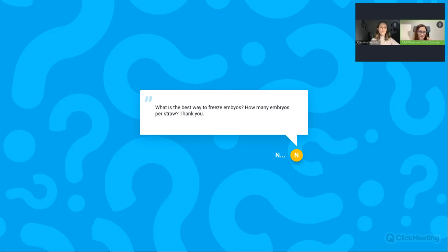Okay, thank you once again. What is the best way to freeze embryos? How many embryos per straw? At our clinic, we perform vitrification, and I think I can say that most clinics vitrify embryos, which is a very rapid freezing of the embryo, and that assures a high viability of the embryo at the thawing procedure.